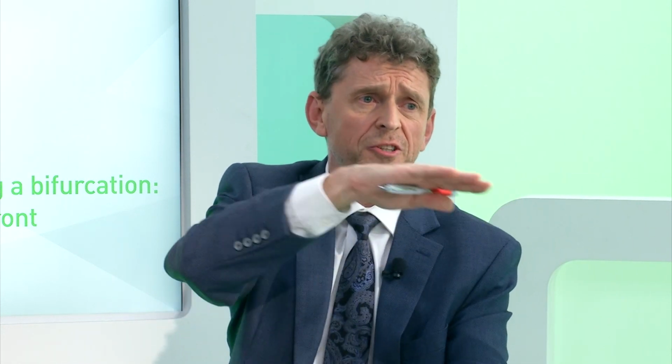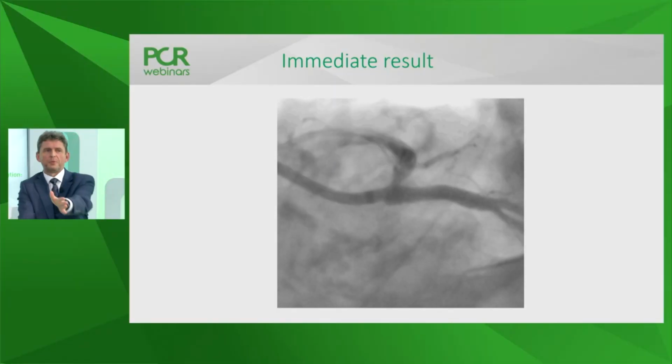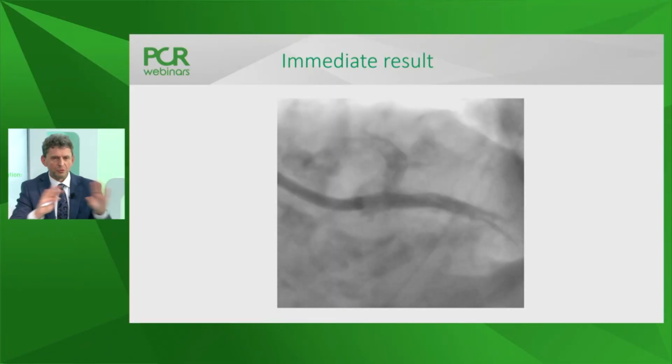But now, just to avoid, and which is especially important in the left main, because your guide is very easily pointing towards the gap between the stent and the wall, especially in techniques when you have a jailed wire in the circumflex, your guide is always pointing to under the stent. Yeah? So do the POT and then rewire. And then people are frequently afraid, especially in calcified milieu. It's very dangerous to do POT. If you keep in mind that the average size of left main in European guys is more than 5.5, then it's very difficult, almost impossible to really jail the wire and not be able to get it back. So don't be afraid about this.